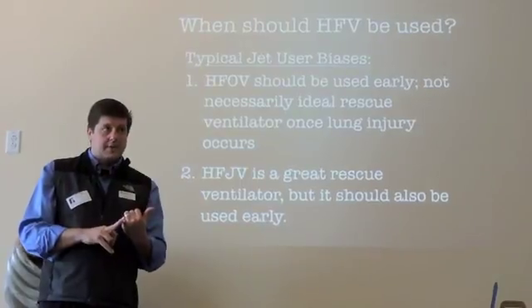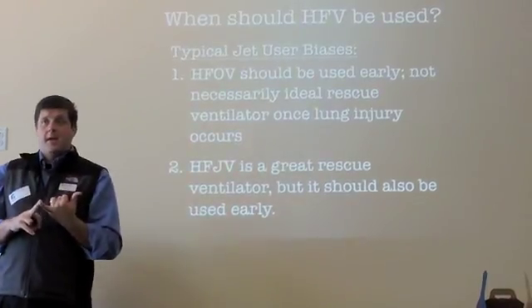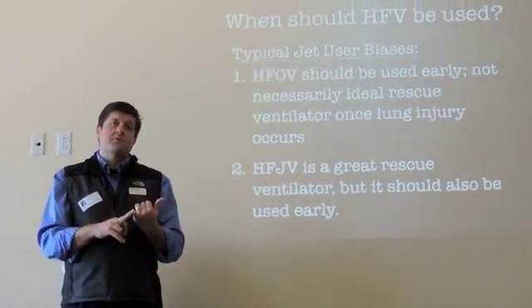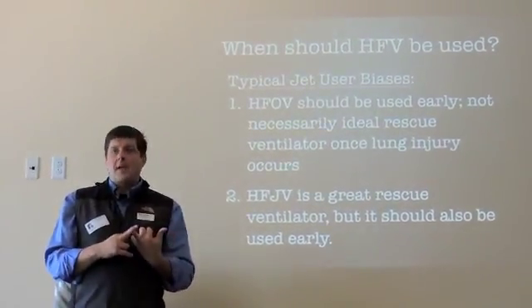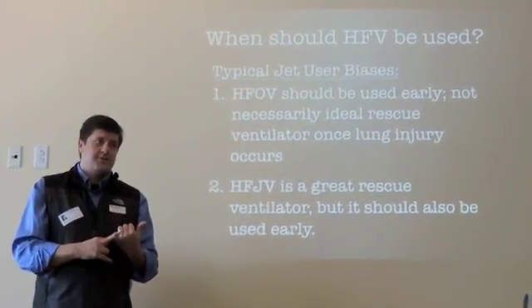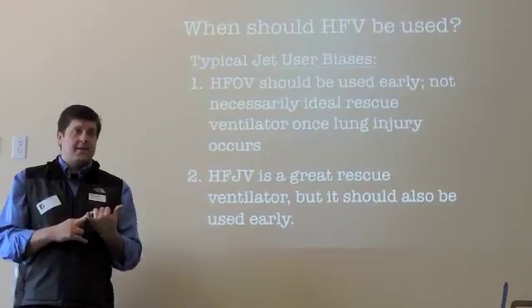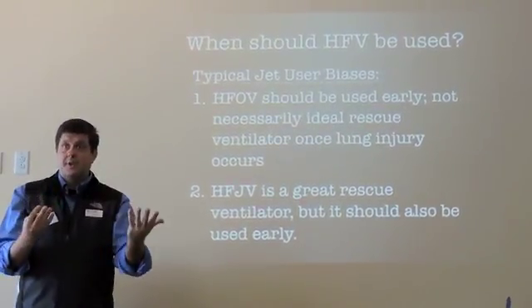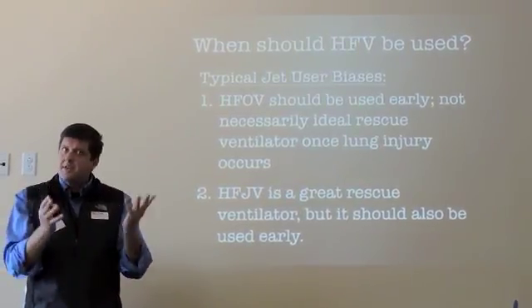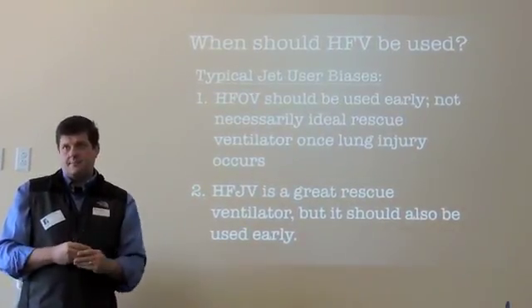The mechanical issue to look for is to make sure we have the right size jet adapter in place. If this is a patient that's intubated with a 3.0 or a 3.5, and we're using the smaller 2.5 jet adapter, that could mechanically cause it. If it's not that, then it's just the patient. Remember, it's a monitored pressure. So as the patient is active and moving around, he's causing changes to the pressure. And if the servo can't keep up with all those types of changes, you'll get a cannot meet PIP alarm. It doesn't mean the jet's not working. The jet is working. It's just not able to stabilize the PIP.